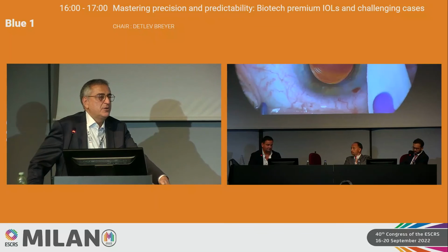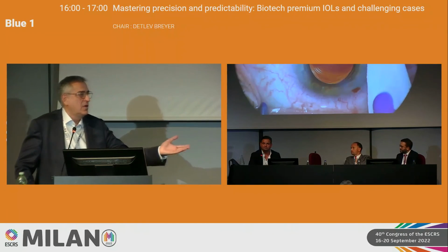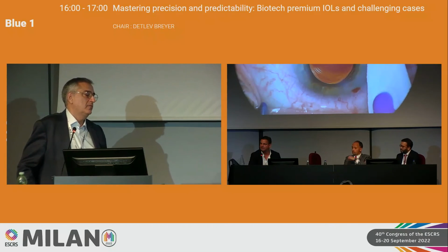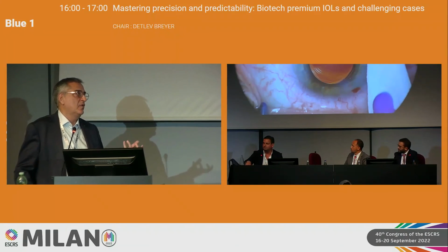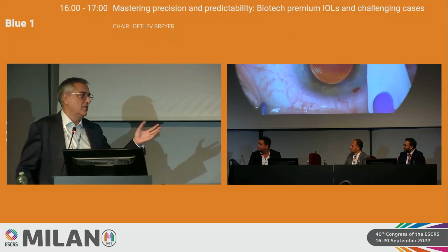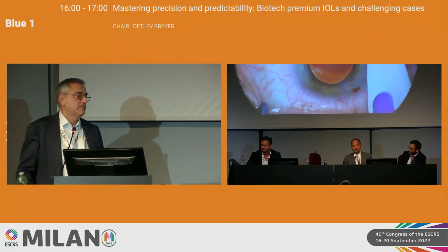Yeah, the main issue is to select the best suitable candidate for the trifocal IOL, especially for the halo and glare, for the dysphotopic phenomena. And it's well tolerated when you implant a trifocal IOL monocularly. Yeah. The other eye is phakic, or the other eye is implanted monofocally, but should have 20/20 vision at distance. Thank you. It's well tolerated.